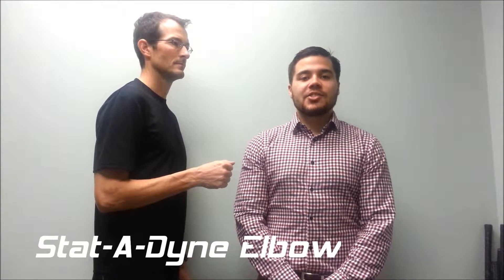Today we'll be taking measurements for the Statodyne elbow flexion extension device. These measurements should be taken in inches and they should be loose tape measurements.